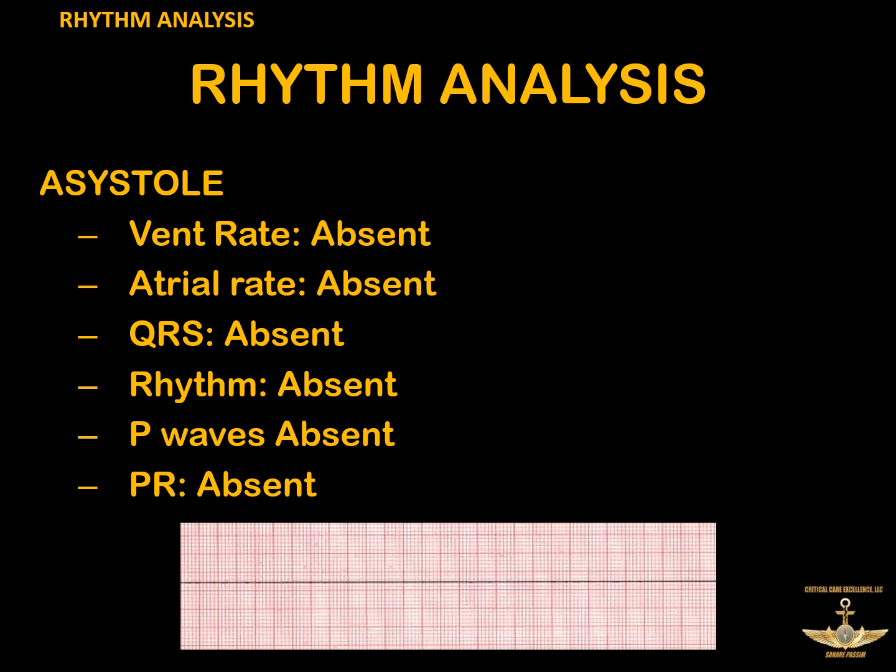But if you encounter somebody who's in cardiac arrest and you first put them on the monitor and you see that they have no electrical rhythm, you're then going to make sure that all your wires are connected, all your leads are stuck on, everything is like it's supposed to be, and then figure out that they actually don't have any kind of rhythm. It won't always be flat like this. They describe asystole as being flat line. It won't always be like that.